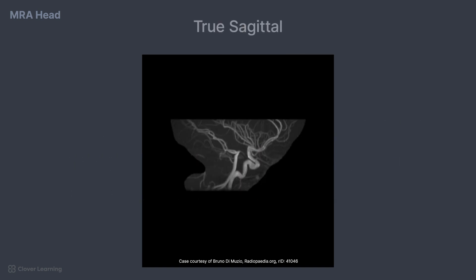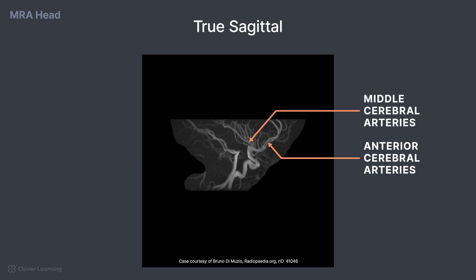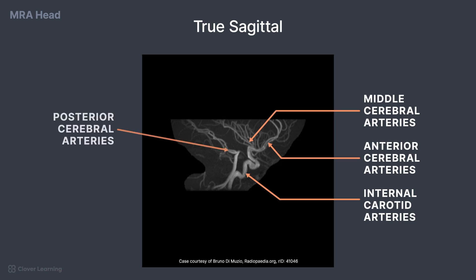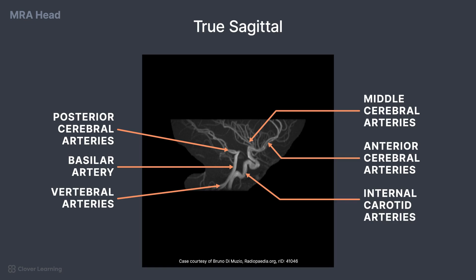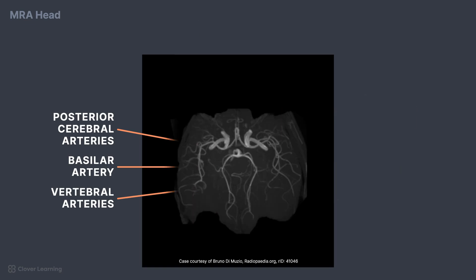On the true sagittal view, the anterior cerebral arteries, middle cerebral arteries, and internal carotid arteries are seen. For the posterior circulation, we can see the posterior cerebral arteries, basilar artery, and vertebral arteries.